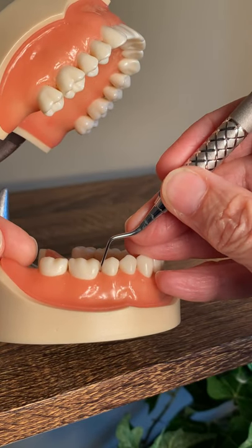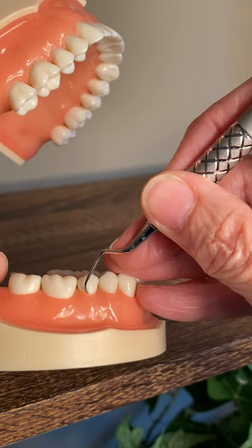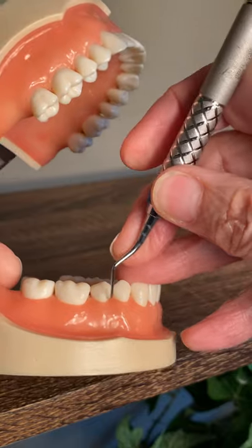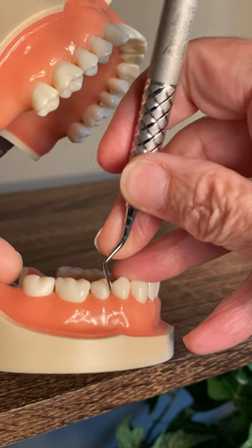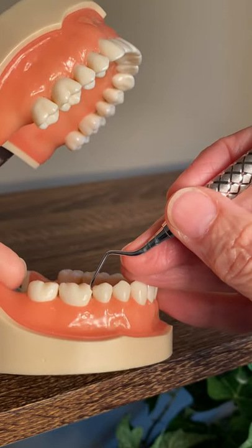I can do the distal of 29, walk it around the facial with the tip pointing forward, and then do the mesial of 29. So I can do everything in the mouth with this one instrument.